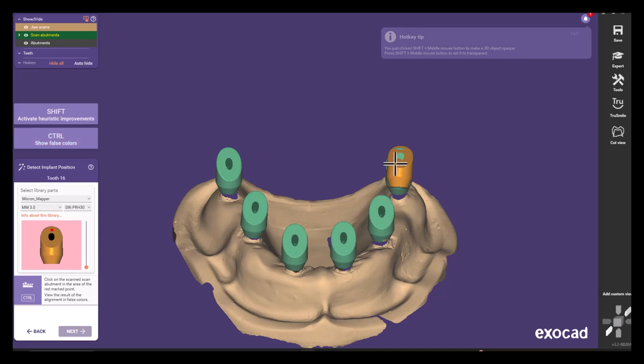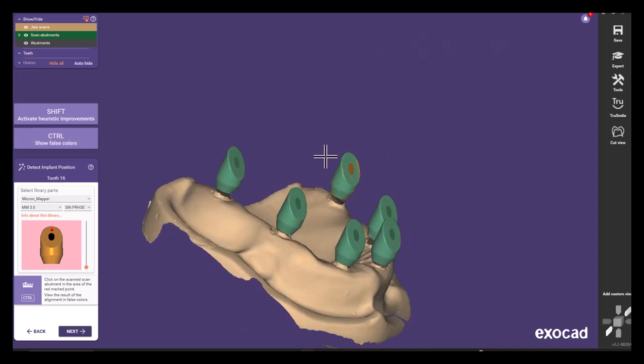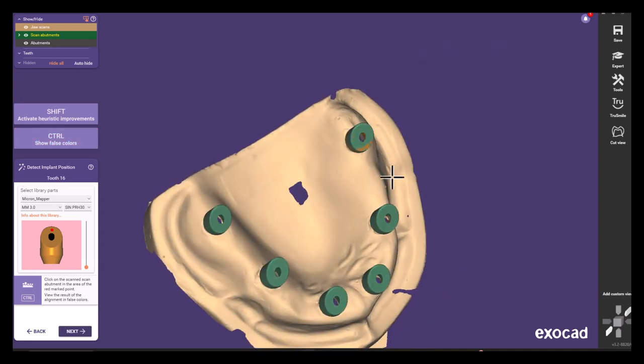And as you can see now the alignment between the scan flag and the actual scan is perfect.